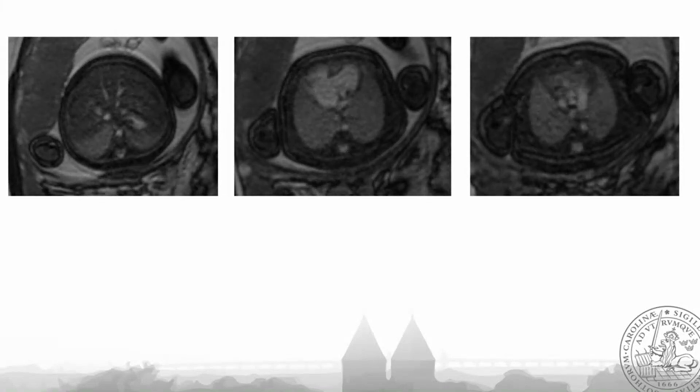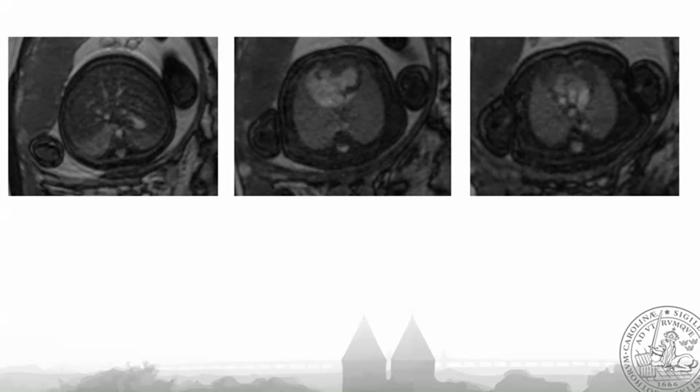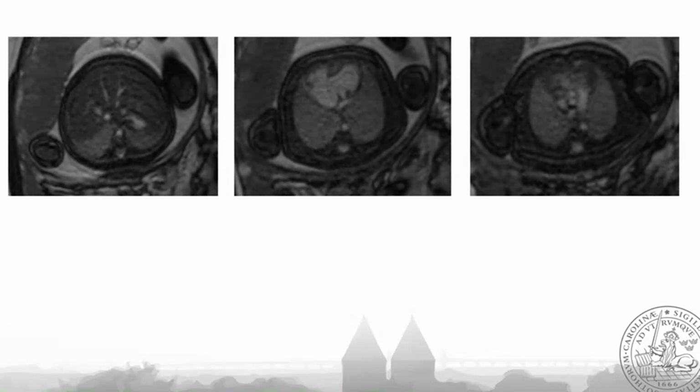So the stomach we see on the patient's left side, and just in front of that, we see a small white dot pulsating. And if we go to the middle image, we see a common large atrium and a larger left than right ventricle in this case, but particularly we don't clearly see any of the pulmonary veins here.